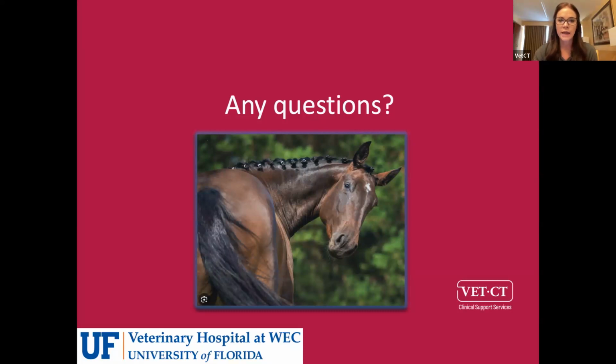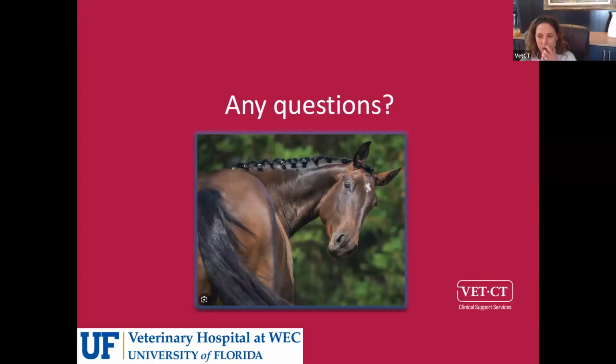First question, can you do flexed and extended views during the standing CT or only under GA, general anesthesia? Yeah, so those are under general anesthesia, and I should clarify that. With the standing CT, we're not doing myelography, so I'm not comfortable. I know there was a paper a while back, I think out of Canada, where they did myelography through the LS space in standing horses, but it's not something that I'm real comfortable with or excited about.